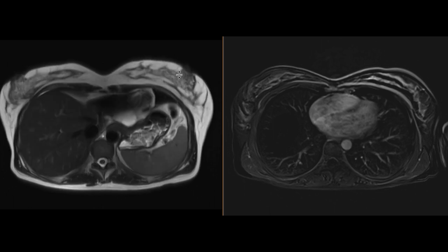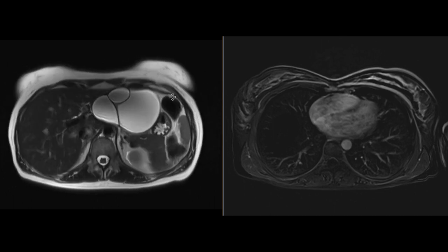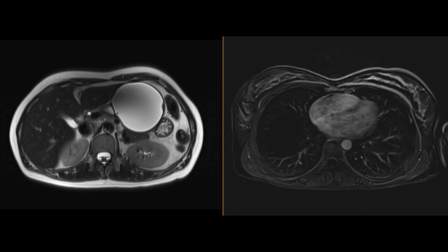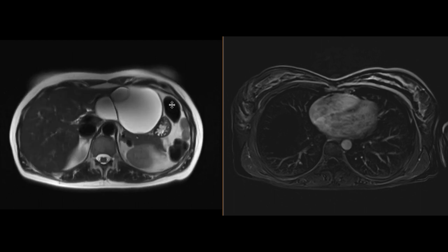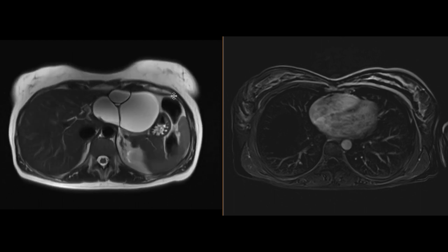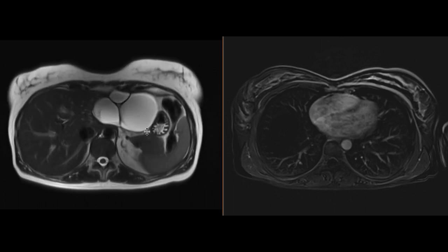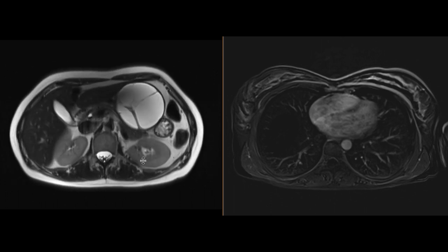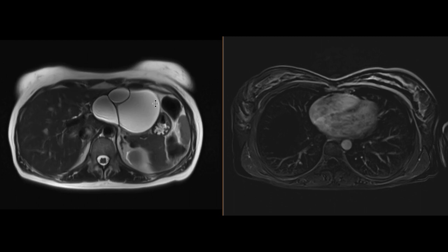As we scroll down in our T2-weighted images, we can certainly see this mass encompassing much of the left hepatic lobe, and it really does look quite complex. It's predominantly cystic, but very multiloculated. There's a lot of septations within it. Some of these septations are quite thick, and it has some more intermediate signal within some components of these locules.